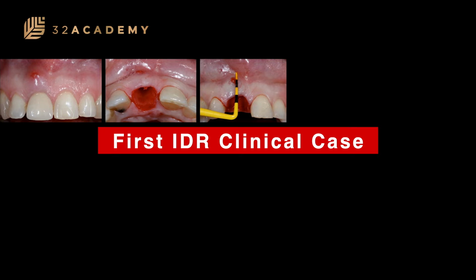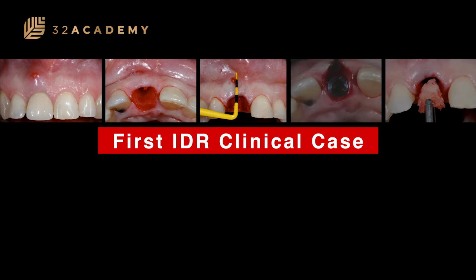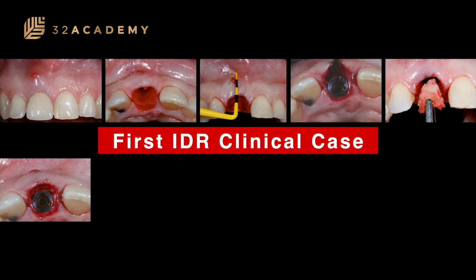So to summarize, what is the main goal of the IDR technique? In the protocol, we perform the tooth extraction, apply minimally invasive procedures, and install the implant in the correct dimensional position. We start the bone reconstruction first using a corticocancellous block bone graft to restore the wall that the patient lost, plus particulate bone as a bone filler. Both grafts are harvested from the maxillary tuberosity.